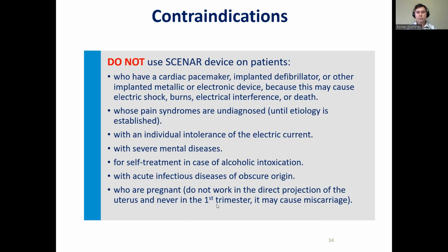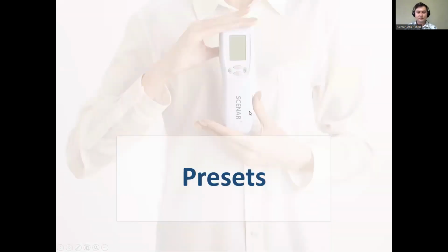This is the rule, because theoretically, thankfully, like we never had such a case, but theoretically, just like every electric therapy, it may cause miscarriage. Other than that, you can use Scenar as much as you want, in any way you want, and in most cases you'll get fantastic results. So let's get straight into it.